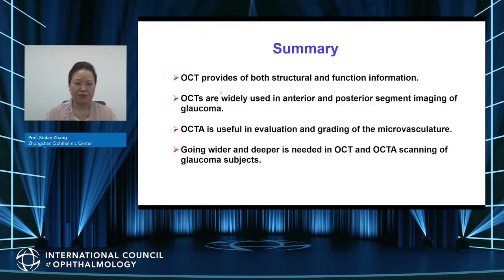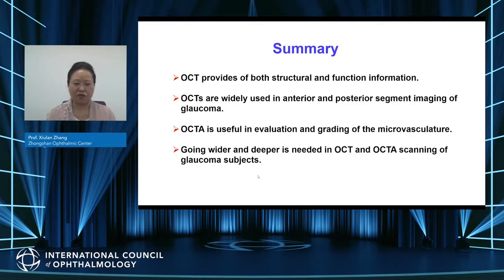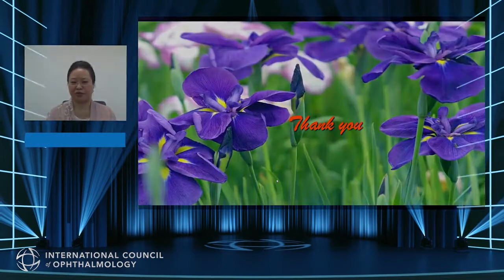In summary: OCT provides both structural and functional information and is widely used in anterior and posterior segment imaging of glaucoma. OCTA is useful for evaluation and grading of microvascular networks. Going wider and deeper is the leading direction in OCT and OCTA scanning for glaucoma. Thank you very much.